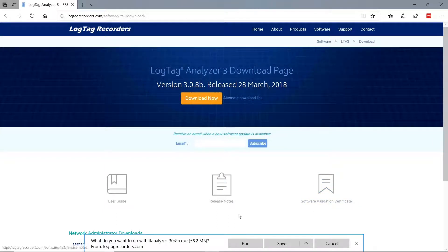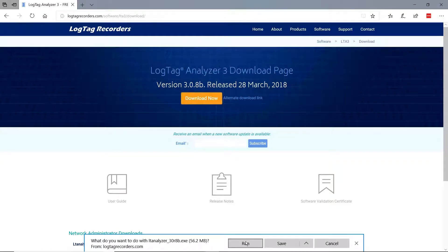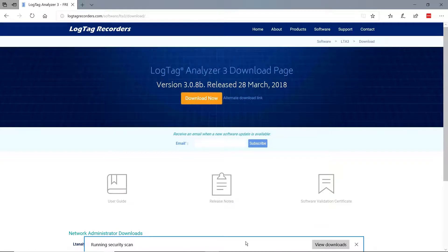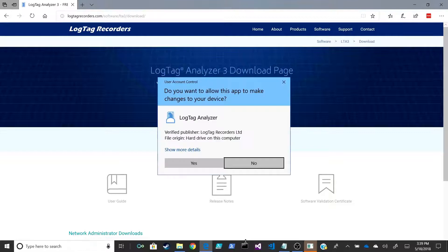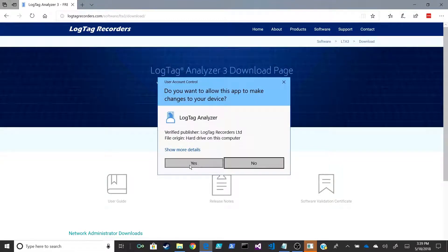Click Run at the bottom of the screen to start the installation. Click Yes to the pop-up asking do you want to allow this app to make changes to your device.